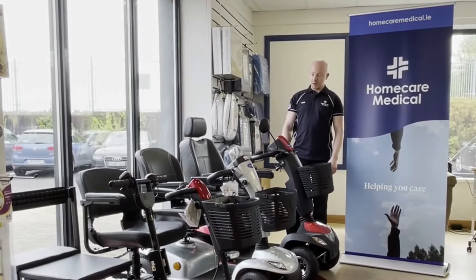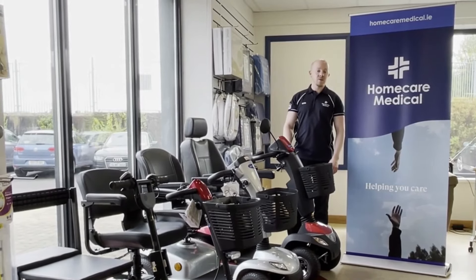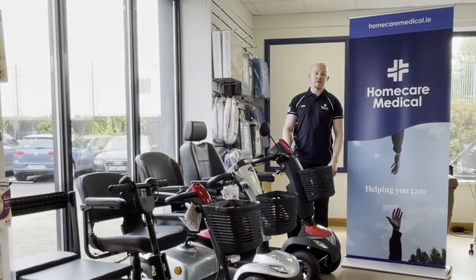If you're looking for a mobility scooter, you can view our entire range in any of our stores nationwide or visit our website, homecaremedical.ie.